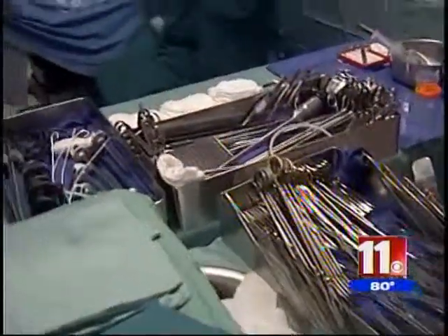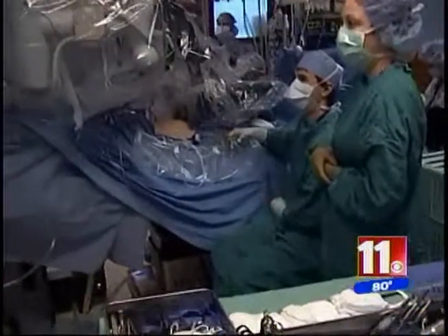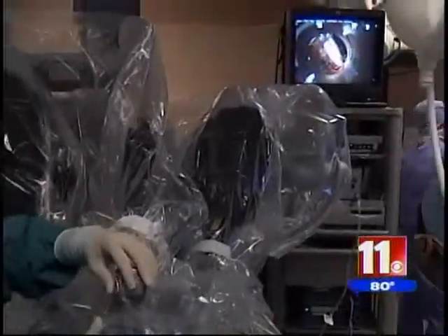Here's what makes the surgery work. The robot doesn't do the procedure. Dr. Abaza simply uses it to make steady, more precise cuts. The bladder is then taken out through the small incision, and the urine will be rerouted to an outside collection bag. I can do an operation with chopsticks, but I can also do the same operation with a fork and knife. Which one would you rather have? Obviously, you'd rather have the much more precise instrument, and that's what the robot gives us.